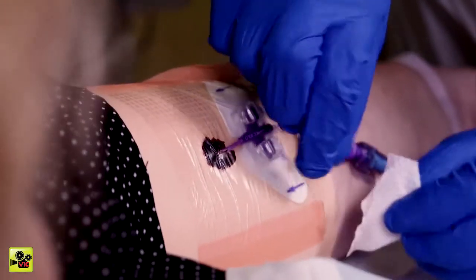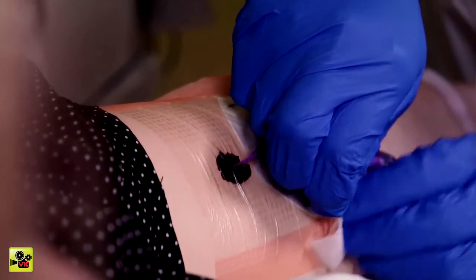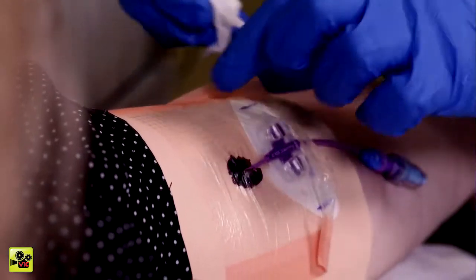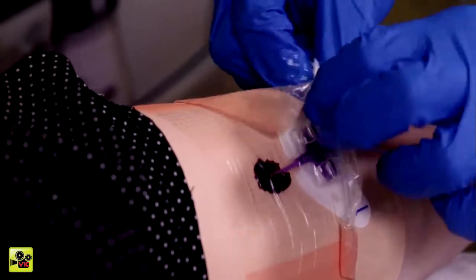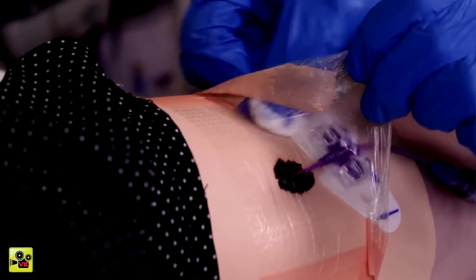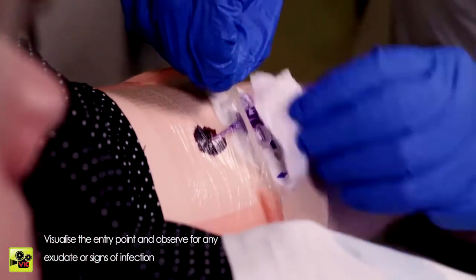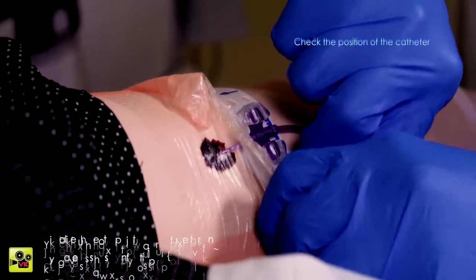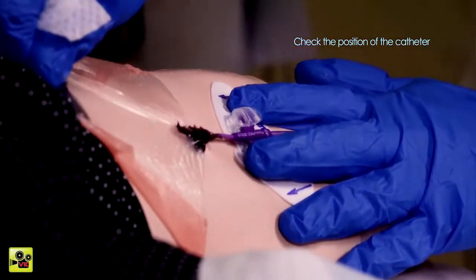Those removal wipes are brilliant. They are really, really good. They make it a lot easier on your skin. I'm just starting at the bottom of the PICC to ensure that it stays in place. Is this feeling all right? Yeah, that's good. It's a bit cold, but it doesn't hurt. Sometimes it just takes a little while. Keep your arm really still. You're doing really well.